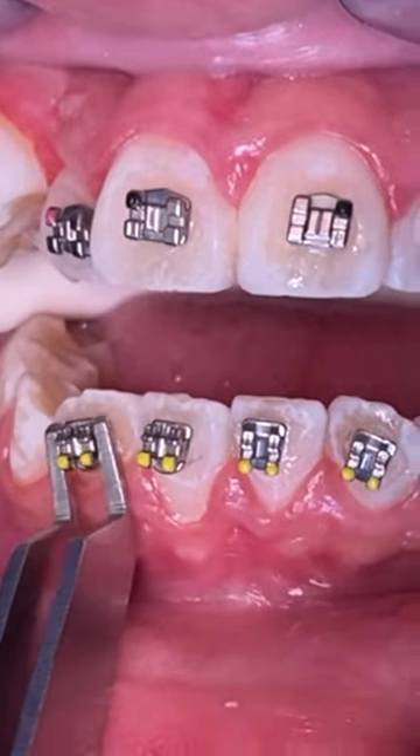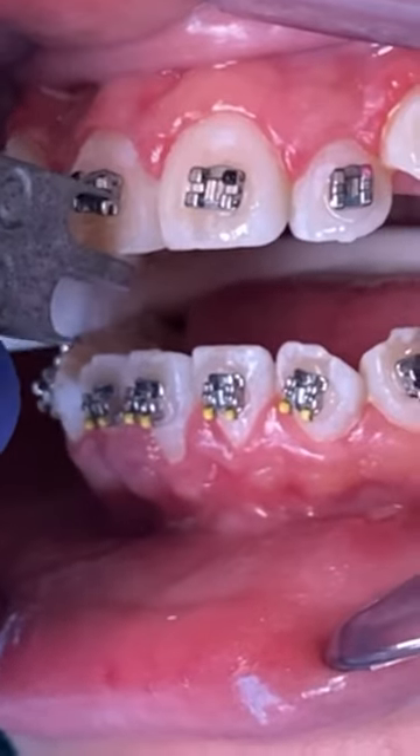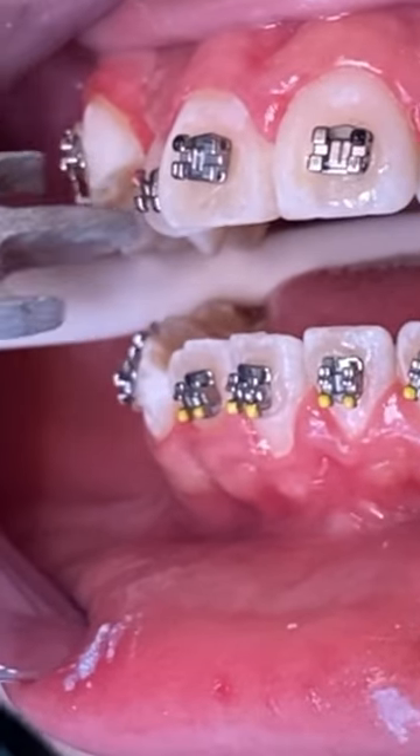Let us know what colors excite you more. If you like pattern solids, rainbow colors — that's definitely the fun part of getting your braces on.